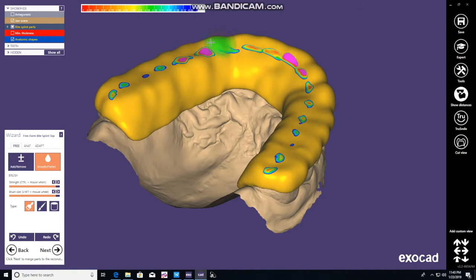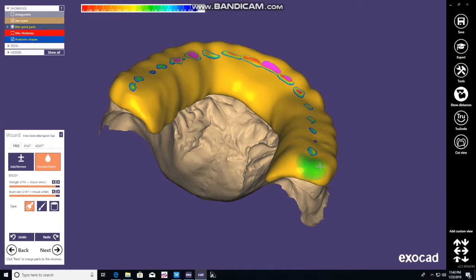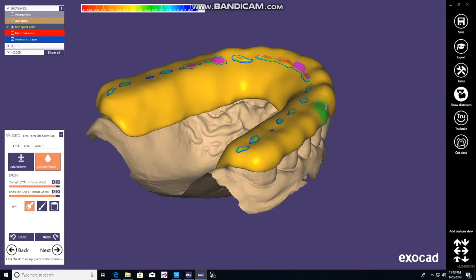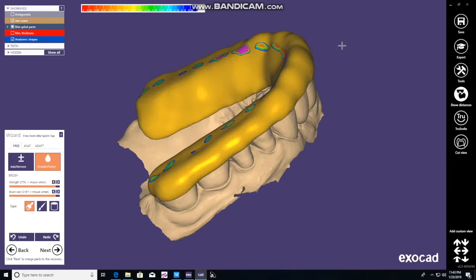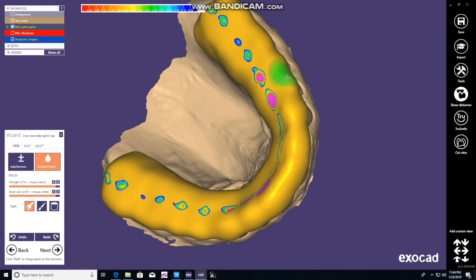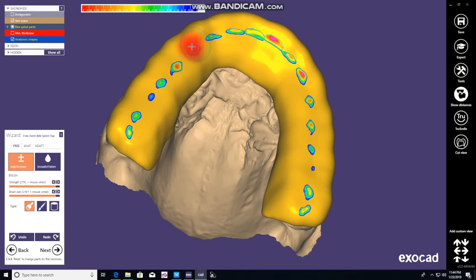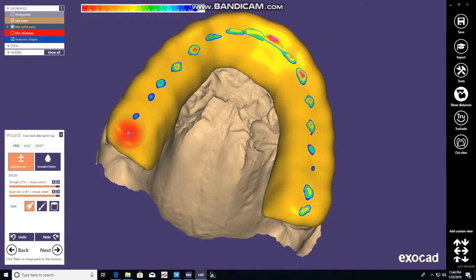Once you've got it to a position or shape that you like, a lot of times we'll go back and change to the add and remove button. Change the brush size and hit Shift and you'll subtract material away. Right now we're flattening — see how it starts to make it more smooth, more comfortable. The idea in the posterior is you don't want any interferences. Now push Shift and you can slowly take away some of that material. The more blue it is, the less contact there is. You just want to strive to keep them as even as possible on all your contacts.